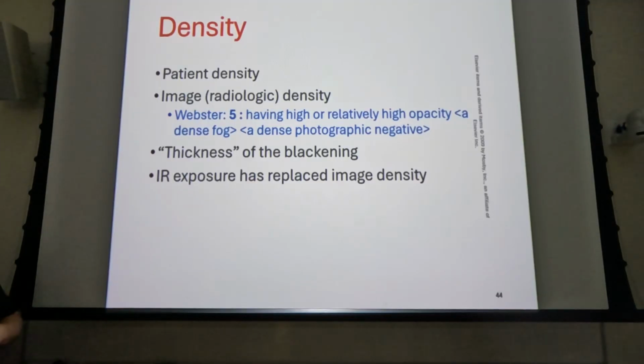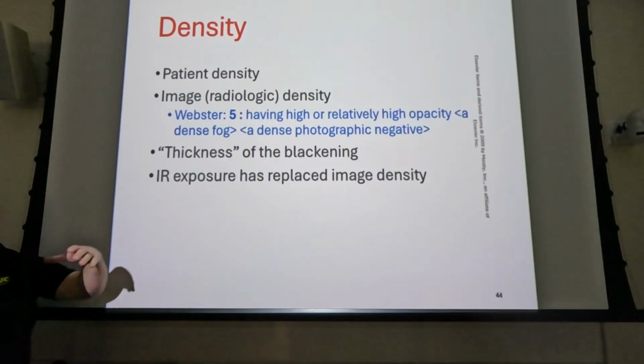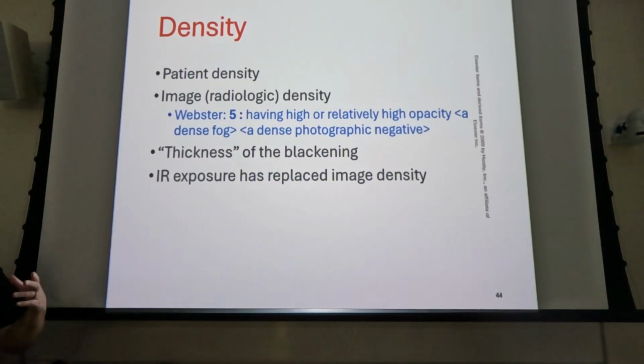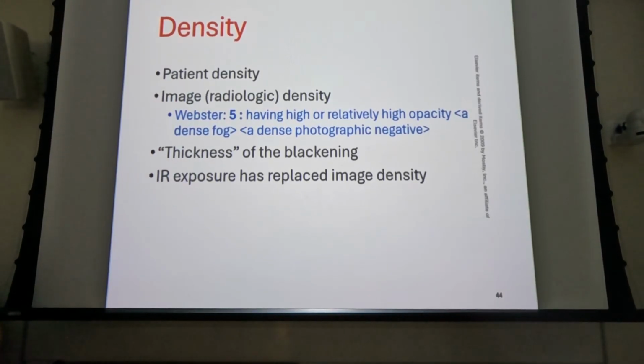All right, so radiographic density is how dark the image is, and it can be a specific area or it can be the overall image. If again you forget to collimate and half of your image is direct exposure to the image receptor, your computer doesn't know what you did. Your applied computer algorithm thinks that you've got a pathology there that is just too easy to penetrate.